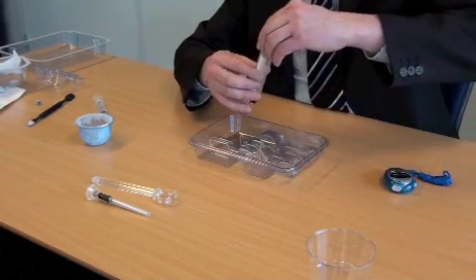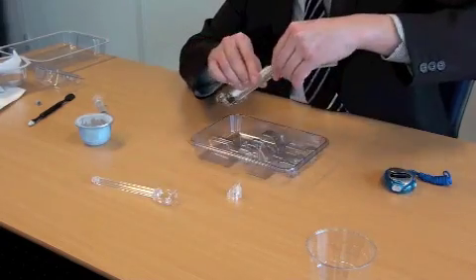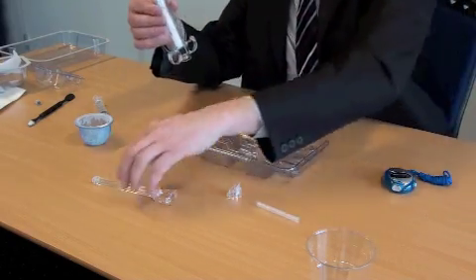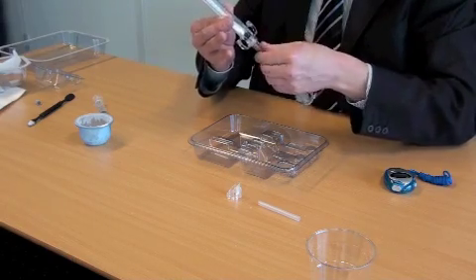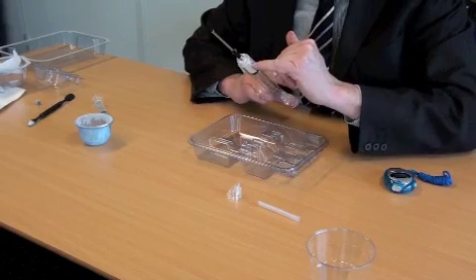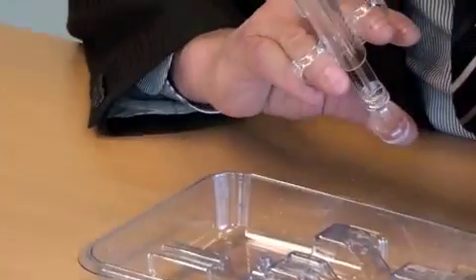Actually, I still have a couple of seconds till 2 minutes and 30 seconds in order to prepare the syringe and get ready for injection. So you see a 10cc can be filled in time. I'm contacting it only here at the rim side. We take the plunger and we just screw it in. And now we're going to release the air. When you release the air, the Hydroset should not enter the cannula, just up to the base. Do not enter into the cannula. Now I'm ready for injection.